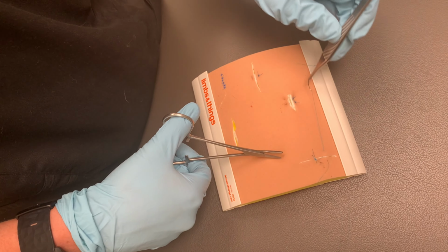Hi, I'm Isaac, and we've got Tyler here, and we're going to be doing the one-handed surgical knots. Indications for this are synonymous with all other sutures. One-handed knot tying specifically is used in the surgical setting for deep tissue, as well as holding instrumentation in place, like drains during a chest tube.